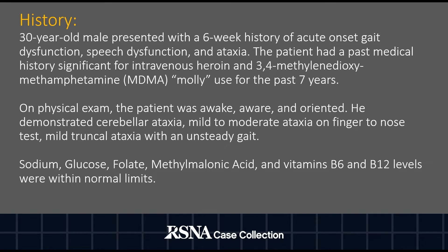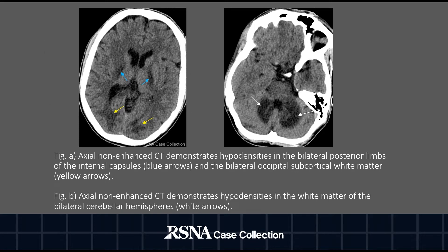His sodium, glucose, folate, methylmalonic acid, and vitamins B6 and B12 levels were within normal limits. The patient then underwent an unenhanced CT of the brain to further evaluate his symptoms. We have two axial cuts of the brain here. Figure A on the left is at the level of the basal ganglia, demonstrating symmetric hypodensities in the bilateral posterior limbs of the internal capsule and the subcortical white matter of the bilateral occipital lobes. Figure B on the right is at the level of the cerebellum, demonstrating hypodensities in the white matter of the cerebellum bilaterally.